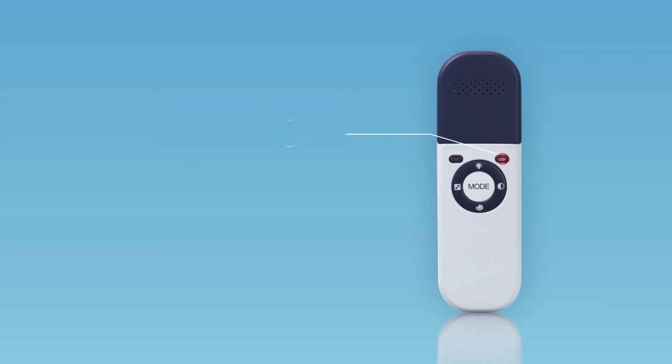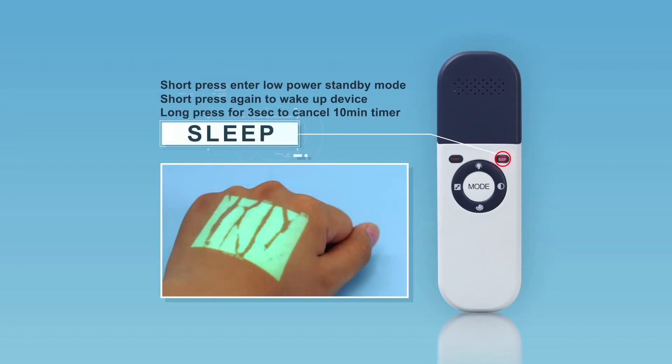Short-press the Sleep button to enter low-power Standby Mode. Short-press this button again to wake up the device. By default, the device enters Standby Mode automatically if there is no operation for 10 minutes. Long-press the Sleep button for 3 seconds to cancel the timer function; the timer character in the top left of the projected image will disappear.